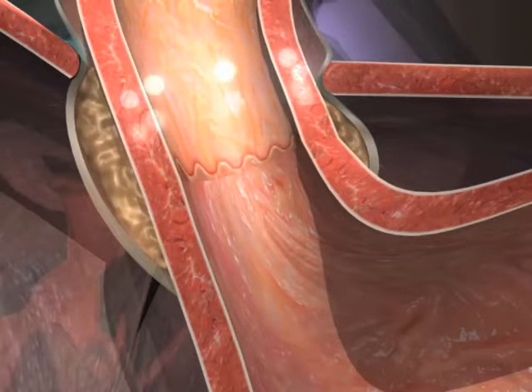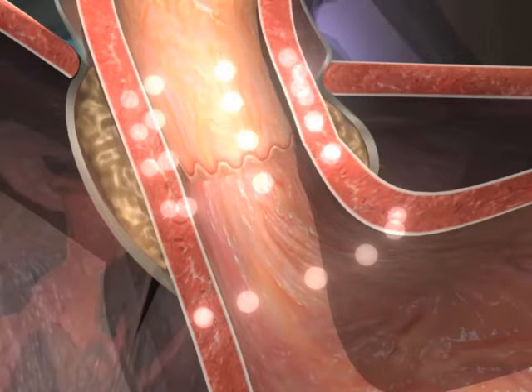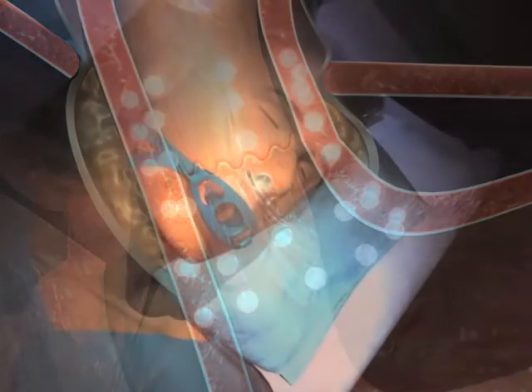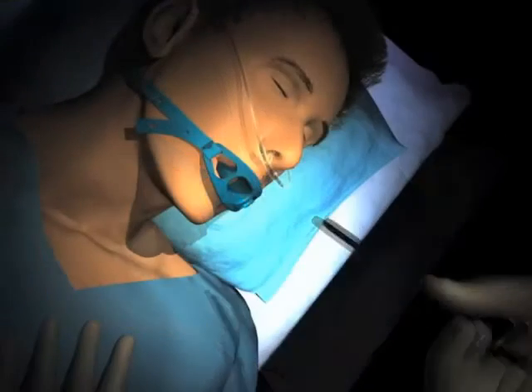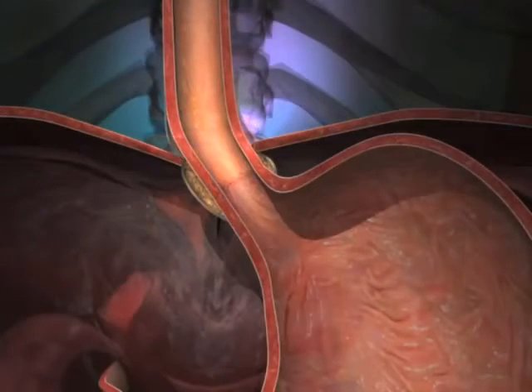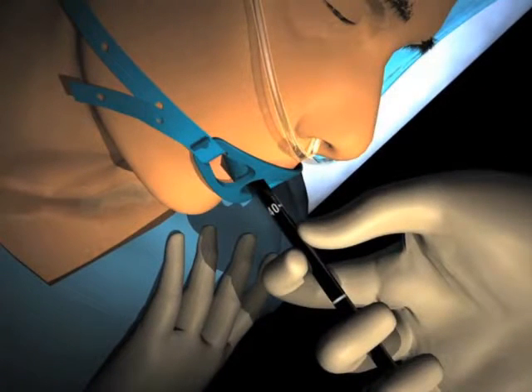The recommended treatments are 4 antegrade rings in the distal LES, 5 mm apart, and 2 pullback rings in the gastric cardia. 24. Endoscopic inspection, measurement, and guide wire placement confirms the location and depth of the patient's Z-line. After advancing the endoscope to the Z-line, measure the distance from the bite block to the Z-line. 25. It is recommended to repeat this measurement three times to ensure accuracy. Record the Z-line measurement, then establish the location of the first treatment level by subtracting 1 cm from the Z-line measurement.